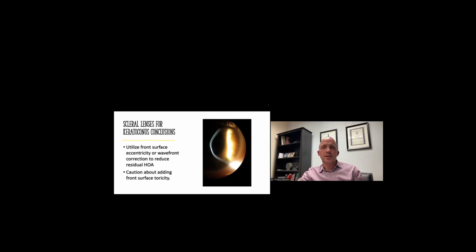There are patients that need and do better with front surface toricity, but be careful that's not just trying to mask other aberrations. And with that, I will take any questions that you have.